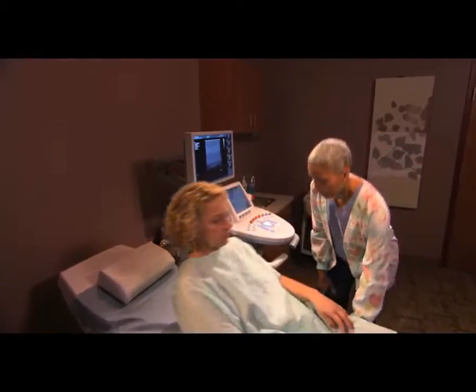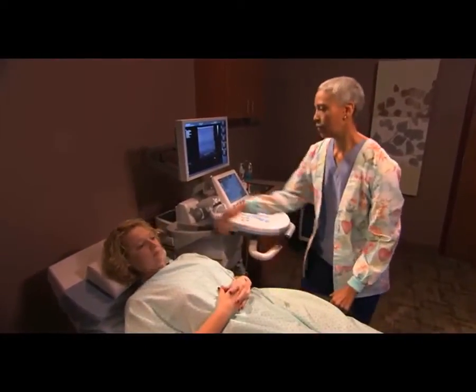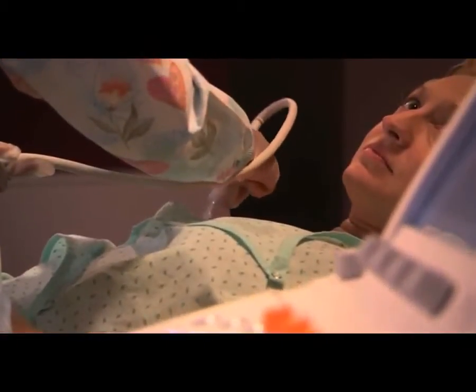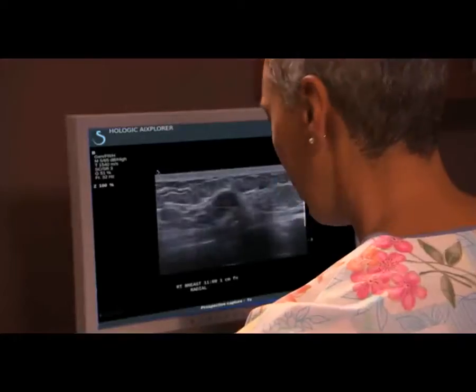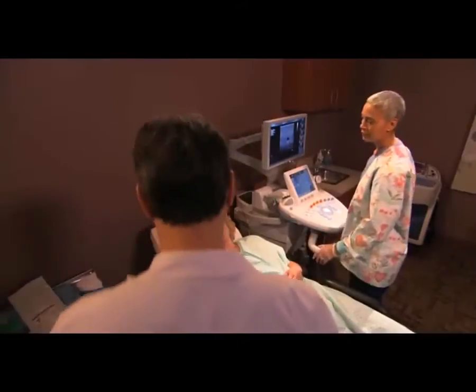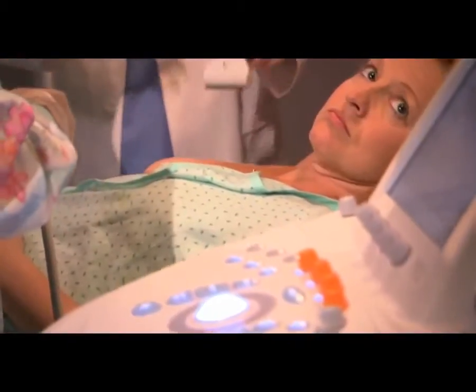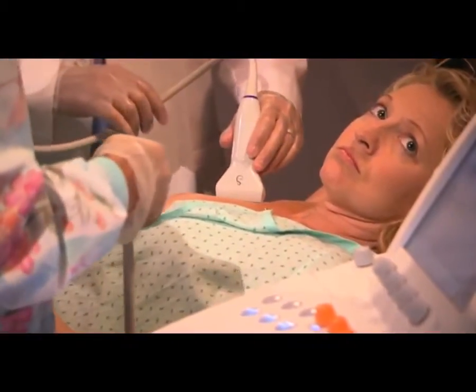First, you will lie face up on an exam table. An ultrasound probe will be used to locate the exact point in your breast where they want to take a tissue sample. At this point, your physician comes in and double checks the target position with the ultrasound device.